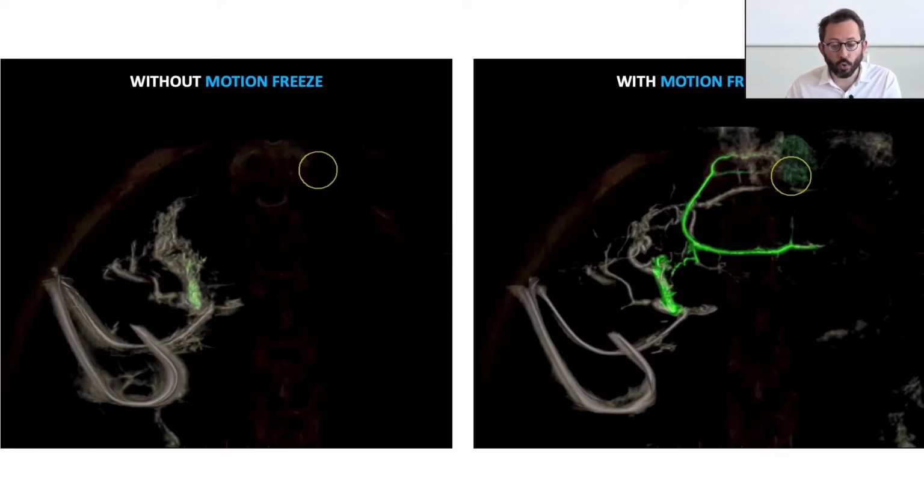And you can also use guidance software for the intra-arterial treatments. And on the left-hand side, you see that the guidance software cannot identify the feeders of the tumor, and on the right-hand side, they manage to regain their visibility. So based on the same very blurry images, you can use them, and you will reduce the need for redo of CBCT. You will not give up on using the CBCT.